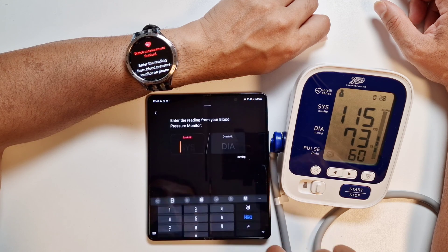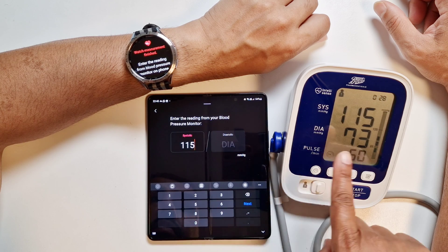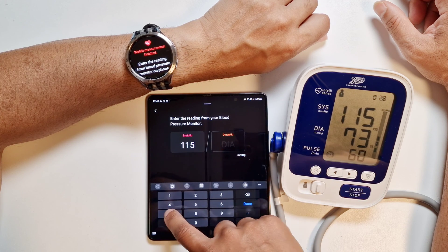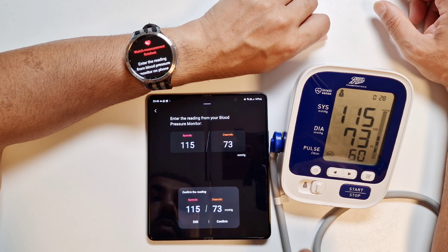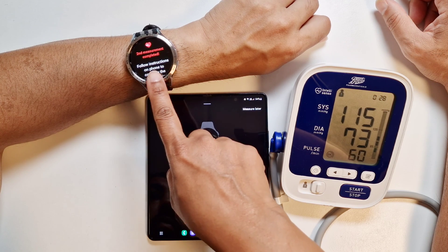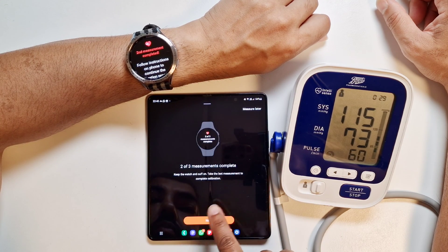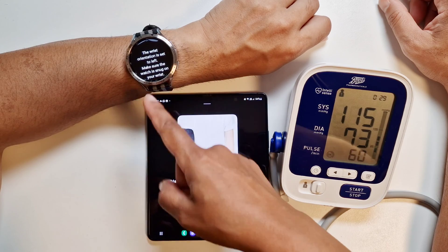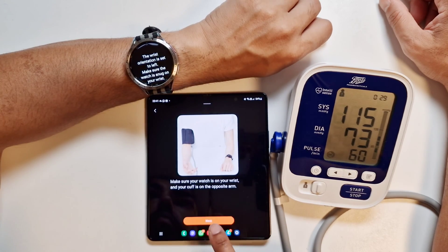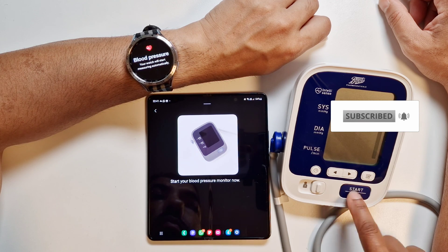We've got the second reading now and it's asking us to enter the measurement. We enter 115 over 73. Done — it's asking us to confirm the reading, so we confirm that. The second measurement is complete on both the watch and phone. We need to continue by clicking next. Same instructions: make sure the watch is a snug fit on your left. Next — start the blood pressure monitor now.